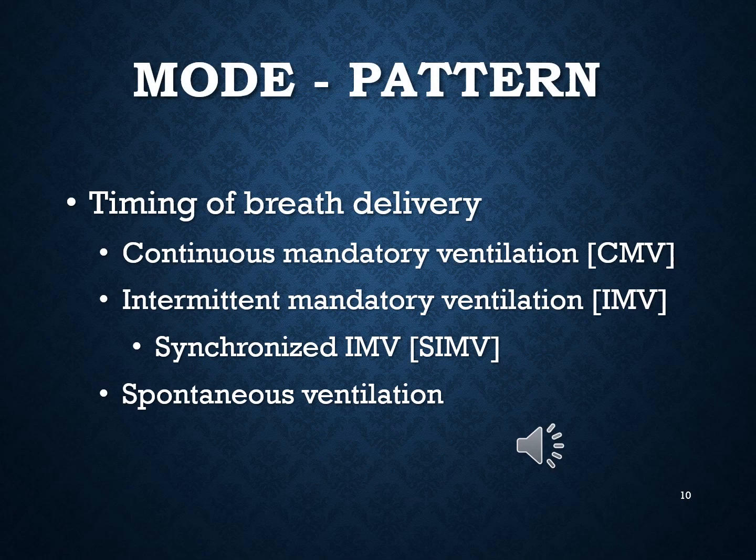The second factor you want to consider in your mode is the timing of your breath. Was it a continuous mandatory ventilation, which is also known as a CMV, or an intermittent mandatory ventilation, or more specifically, a synchronized intermittent mandatory ventilation? Or was it a spontaneous ventilation? And we're going to talk about each one of these in more detail in the next lecture.